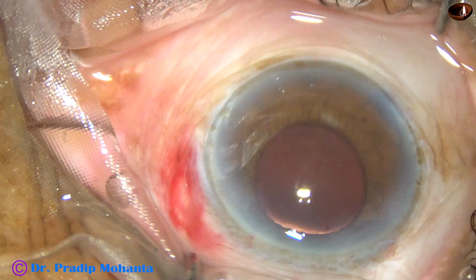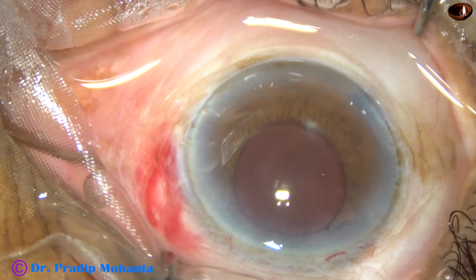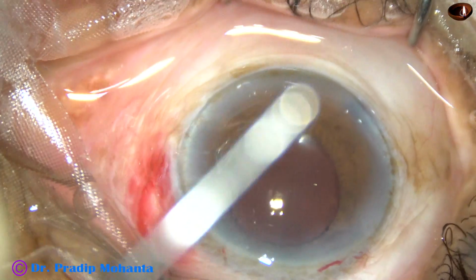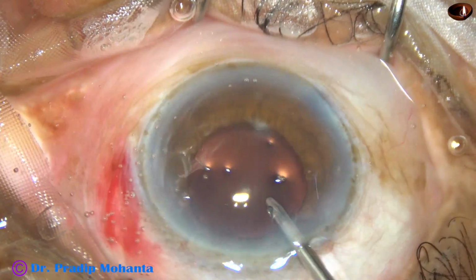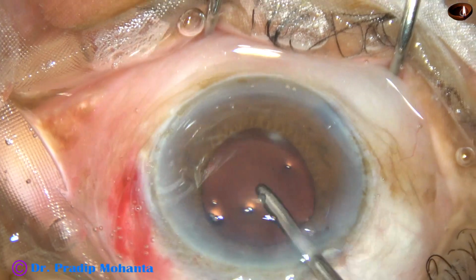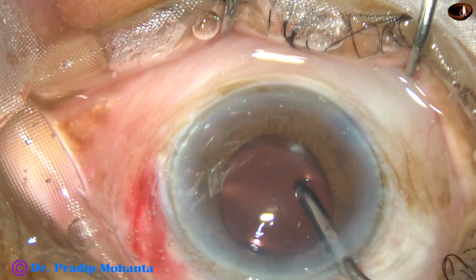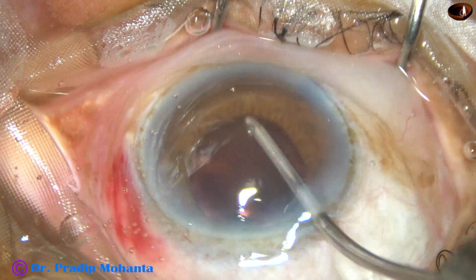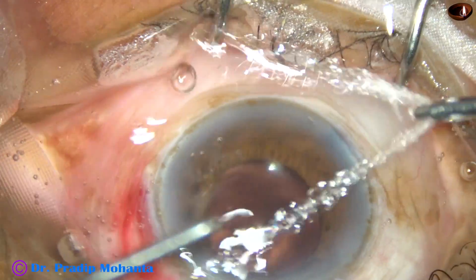And now the visco is nicely cleaned, first with the Simcoe cannula. Please go behind the intraocular lens and irrigate the capsular bag. And then use the irrigating probe of bimanual IA, irrigate the anterior chamber and irrigate the capsular bag also. Irrigate the angle.